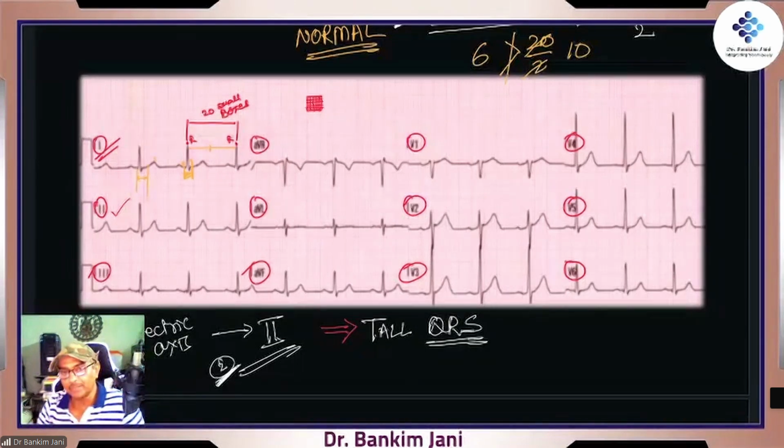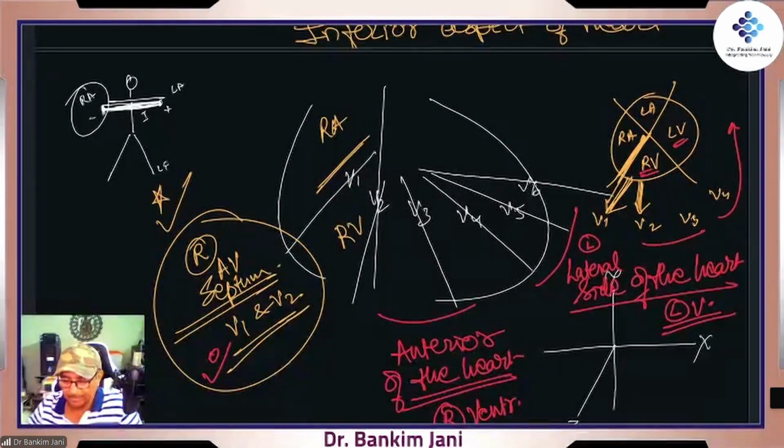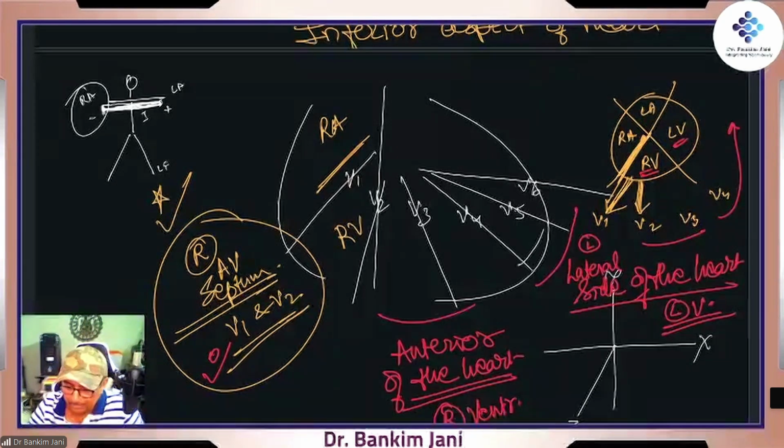The left ventricle is getting watched by V4, V5, V6. They were watching the left ventricle.